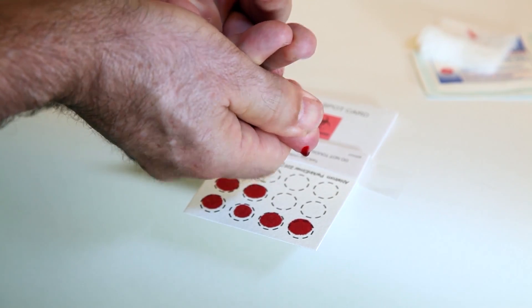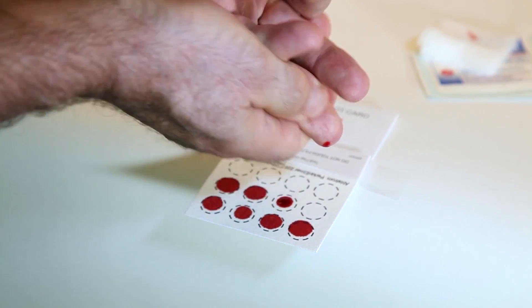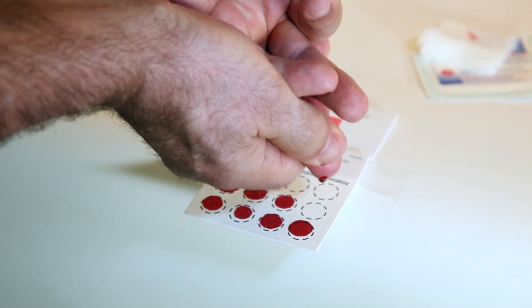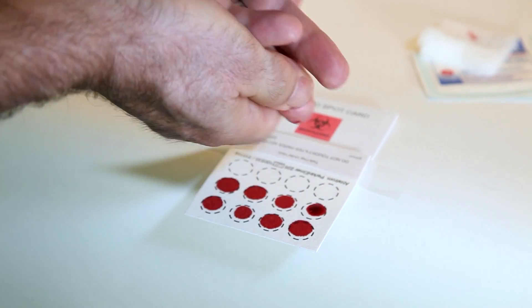If the blood stops flowing before you have collected enough drops, firmly wipe the lancet finger with a sterile gauze — this should help get the blood flowing again. Use the second lancet and another finger if this is not successful.